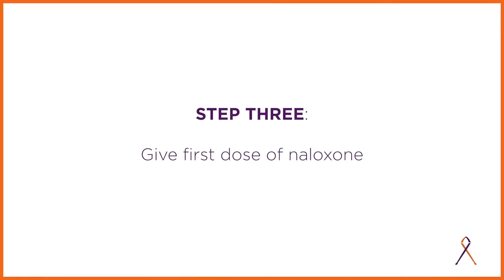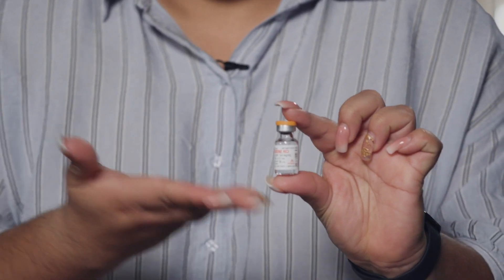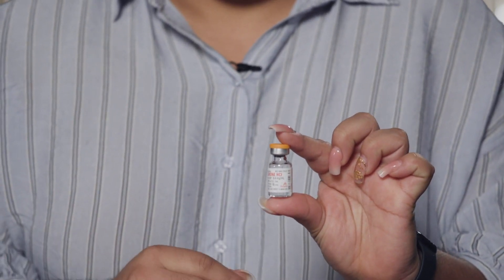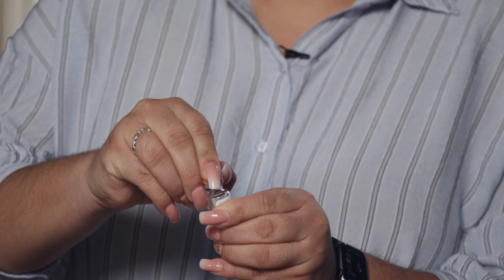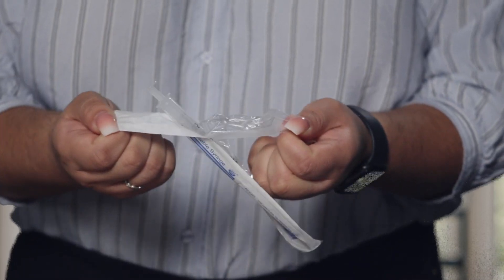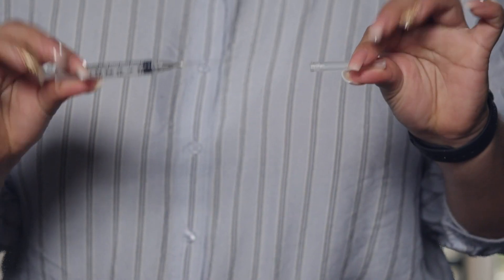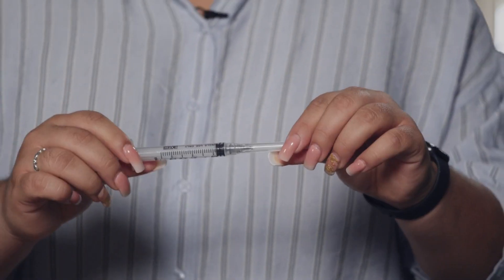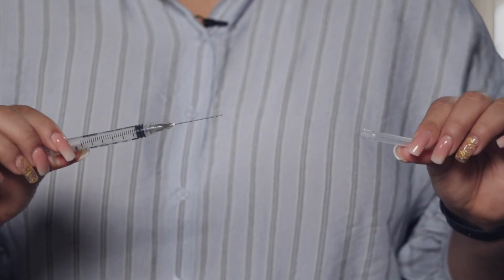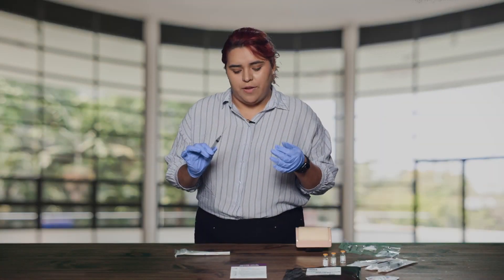Get your naloxone ready. We're showing you the IM intramuscular injection form of naloxone — it comes with a vial and a syringe. Each vial has an orange cap that you will need to remove by popping it off with your thumb or pulling it with your nails. Open up the syringe and take it out of the wrapper. To remove the safety cap, pull it straight off — if you try to twist or turn it, you might remove the needle. Hold the syringe firmly in one hand and pull the safety cap with your other, setting it down so you can recap the syringe after administering the injection.